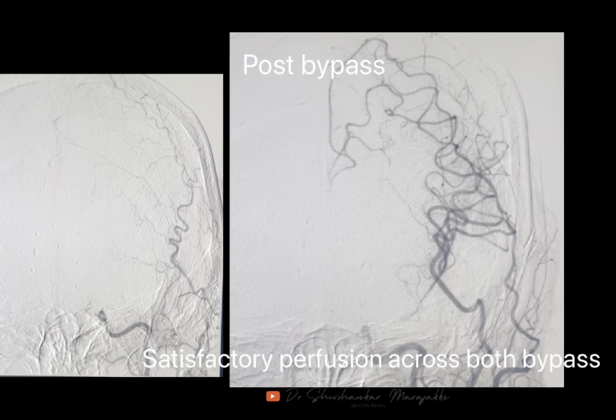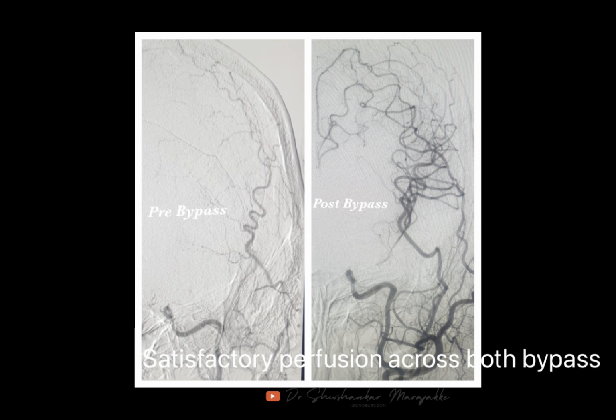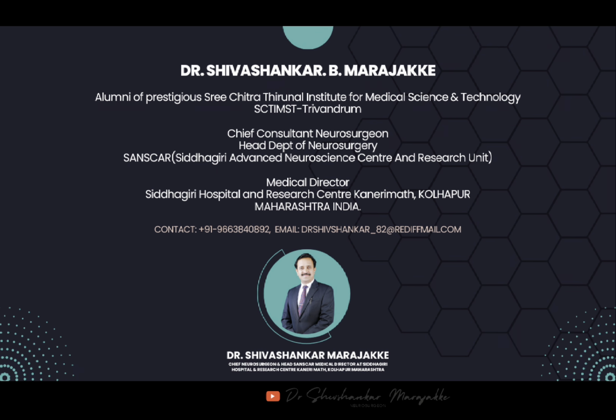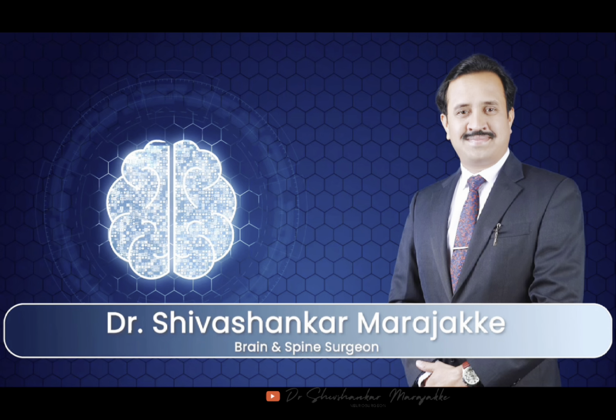Low flow bypass like STA-MCA will grow for distal aneurysms, mainly where we cannot use flow diverters. And with this, the future of bypass surgery looks bright if the surgeon masters the technique, skills, anatomy, and attitude.